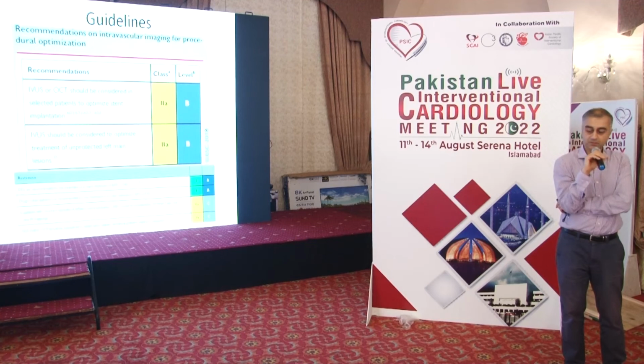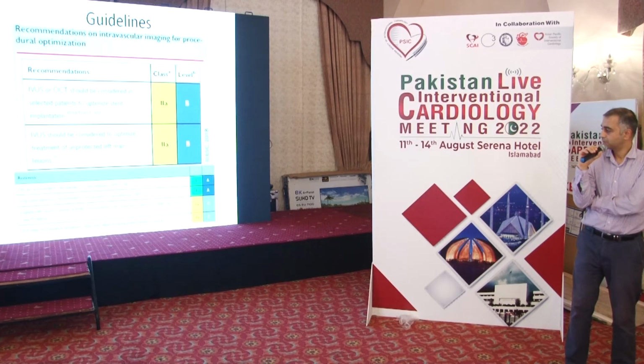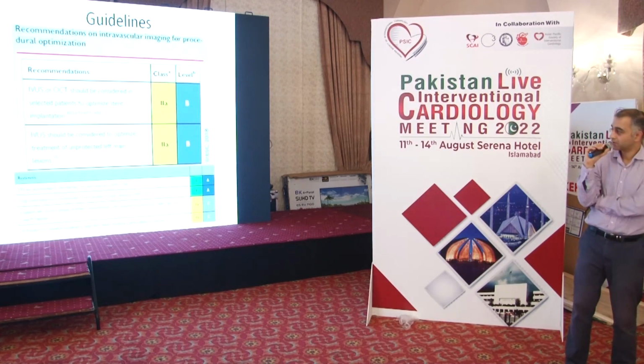So, guidelines suggest that we should be doing this as a 2A indication in the European guidelines. I'm sure that's the same in the American as well. Next slide.